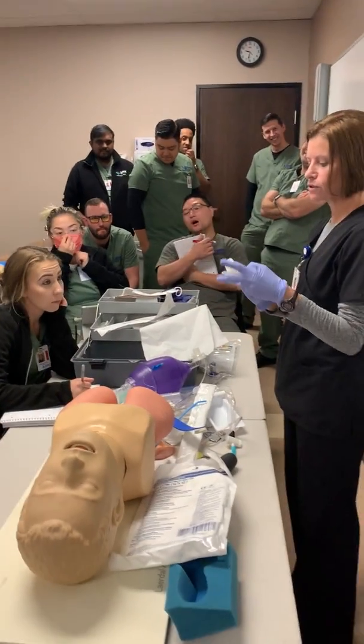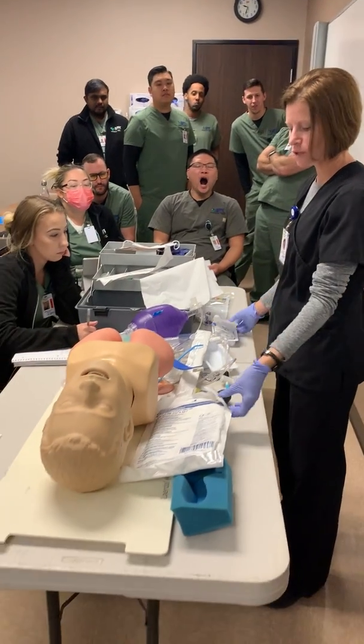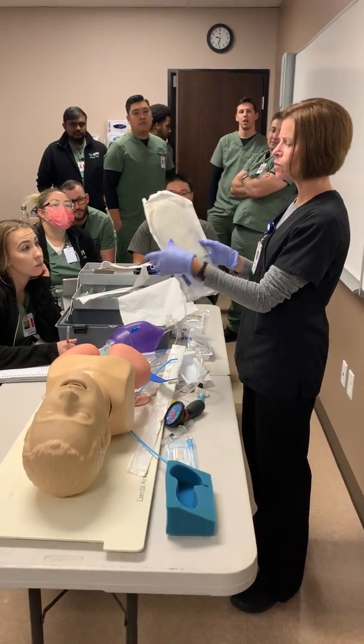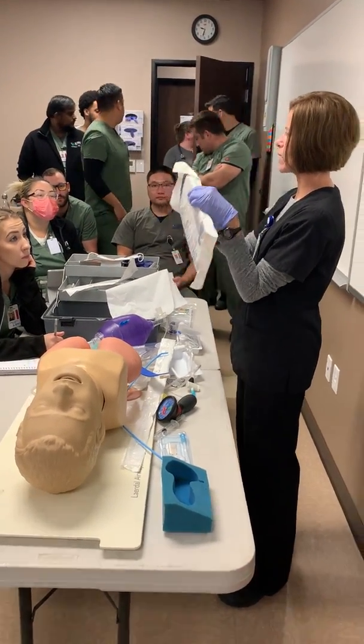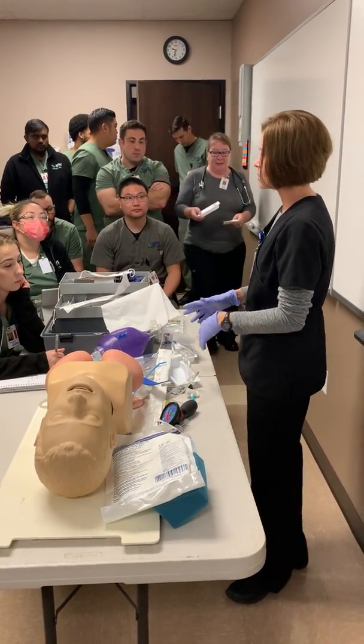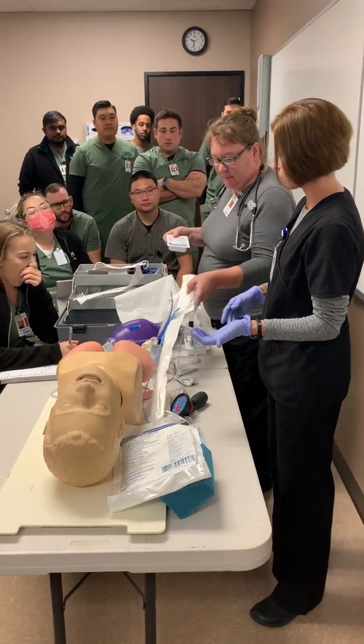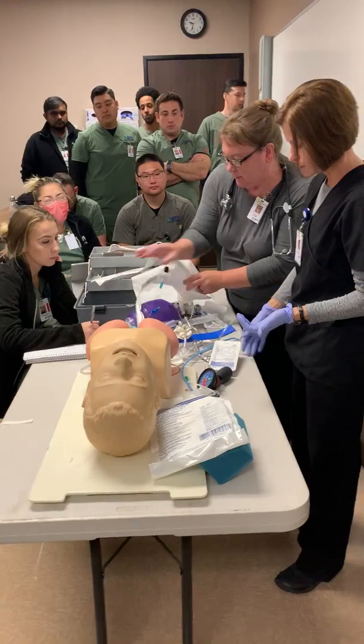Sterile technique, right? You're usually going to see it in a box like this. Some hospitals, it'll almost look like a flat package. It won't be this thick, but it'll be maybe about half the size. Because some of the patients that you're going to suction aren't necessarily the ones in the ICU that are intubated. You might be suctioning somebody out on the floor.